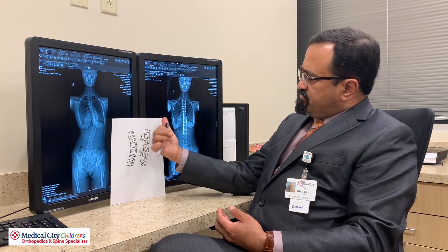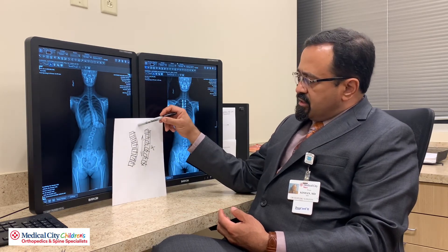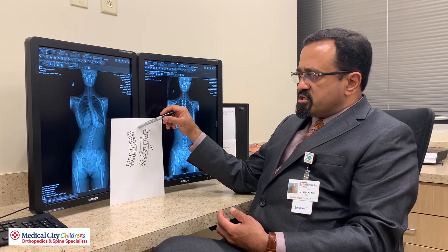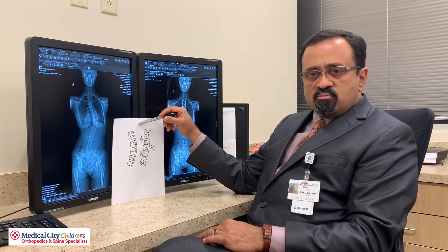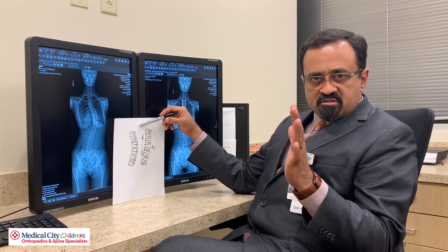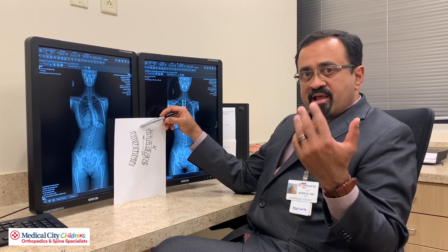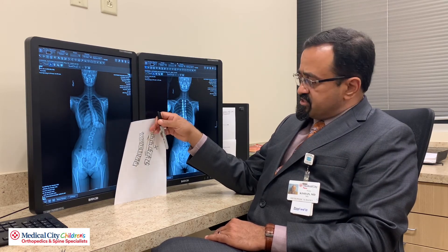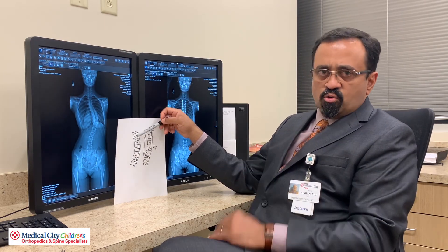People ask: if the fusion is done towards the end of growth, then when can one do a tethering? The difference is that tethering is done earlier. We use a staging classification for growth using the left hand x-ray, and we'd like patients to be early in what we call the Sanders staging — I'd prefer that they are a Sanders 3 or so. It's something we see and calculate on x-rays when patients come in to see us. Unlike the fusion, this is an operation done earlier when the child still has growth remaining.